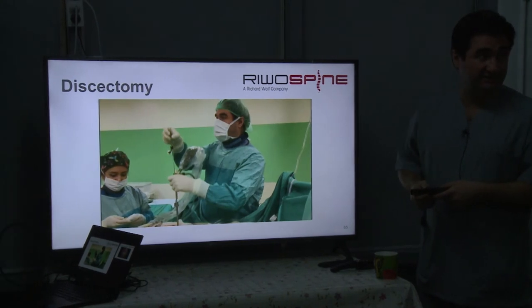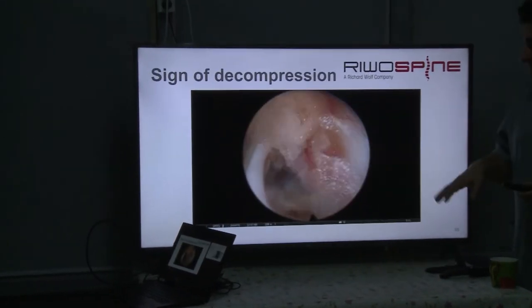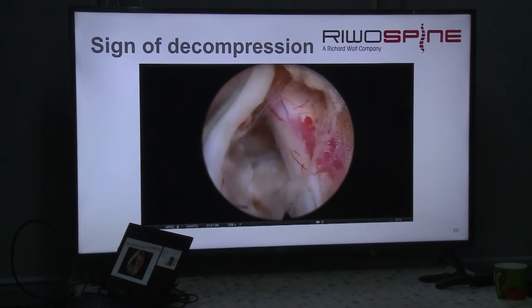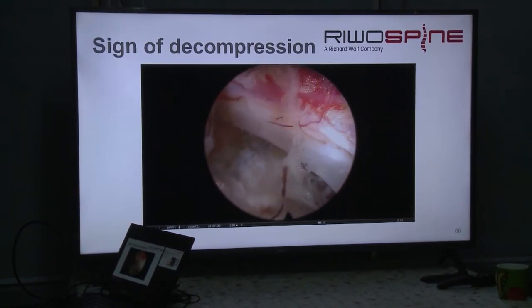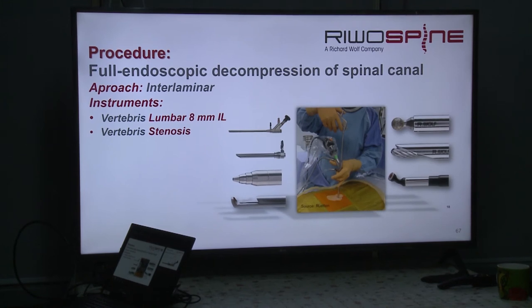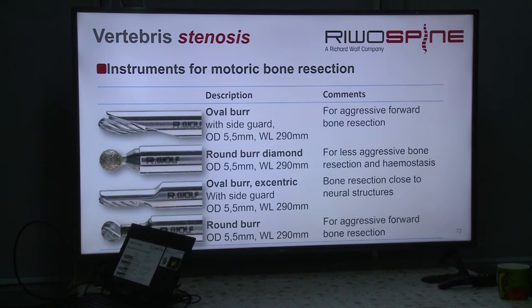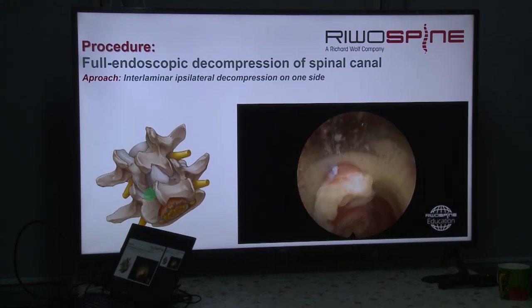You do need assistance. And when you see the floating like this, it's free. Then it's okay. This is the basic steps of the interlaminar approach. You can also do a bone resection with the different types of burrs and everything here. This is another topic, stenosis. It's a little bit advanced.